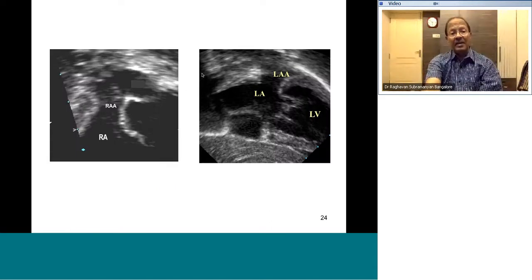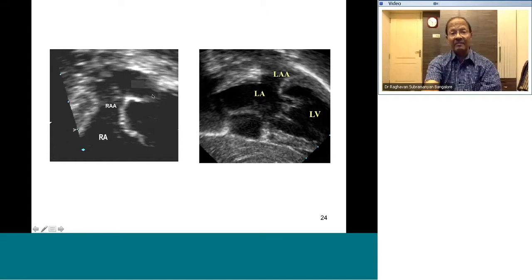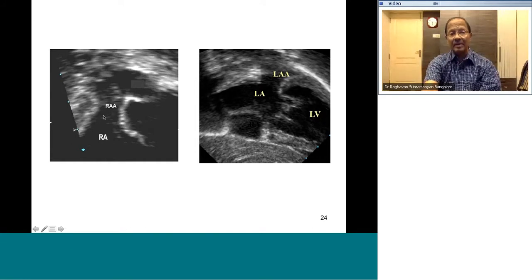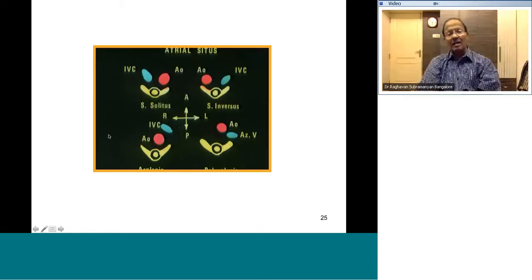You can also show the RA appendage on echo — even if the RA appendage points to the left, you identify it by its broad triangular shape. The left atrial appendage is a long finger-like structure. Therefore the broad triangular appendage is morphological right atrium and the long finger-like appendage is morphological left atrium. Note: even if the RA appendage points left, its morphological identity is determined by shape, not position.